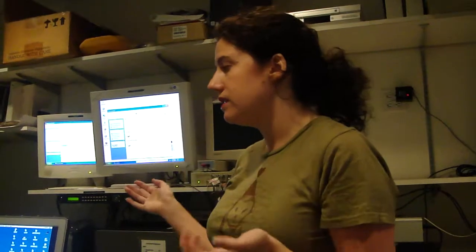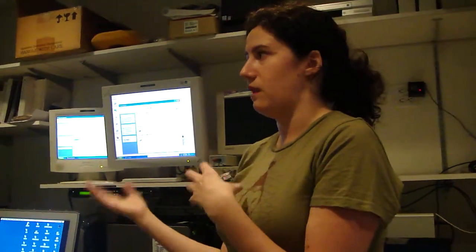But then as soon as you do know it's on your subject, you have to be really careful and make sure that you don't accidentally give a stimulus. And also let the subjects know, one of the things that's really important when you're preparing the subject is that they should always know when the stimuli are coming up. Obviously it should be within the context of your experimental run.